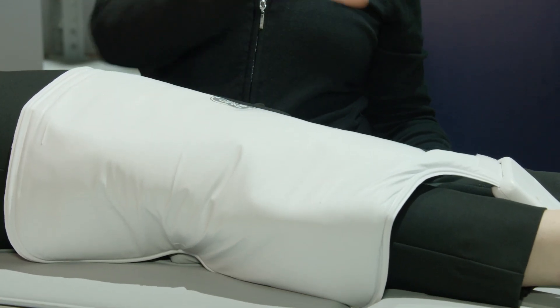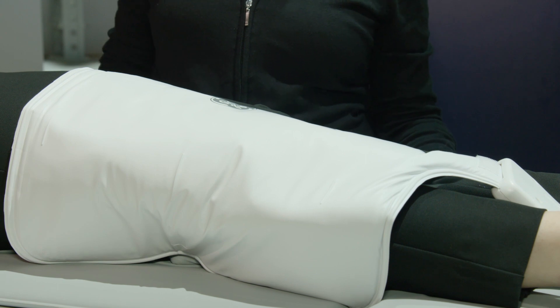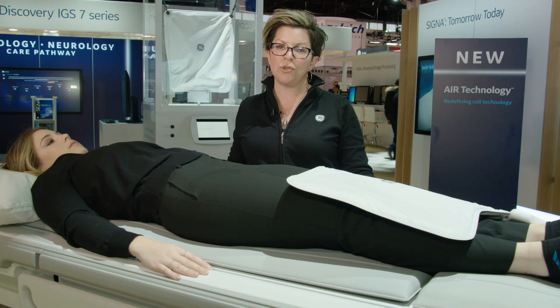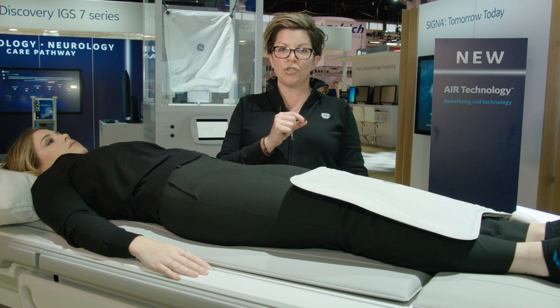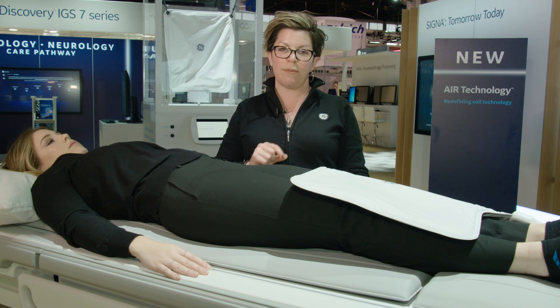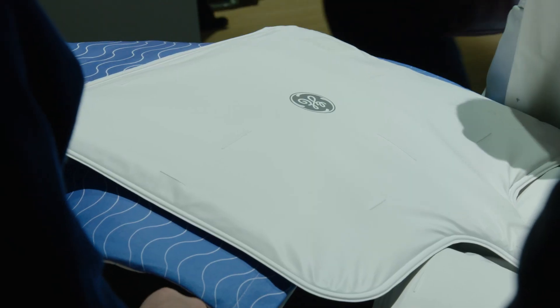Think about the knee, the ankle, the shoulder, or the wrist. All of that is made possible by having the right coil configurations chosen by AirTouch, which selects the right coil elements every time. With the highest channel coil count in the industry, GE is leading the way when it comes to coil development.